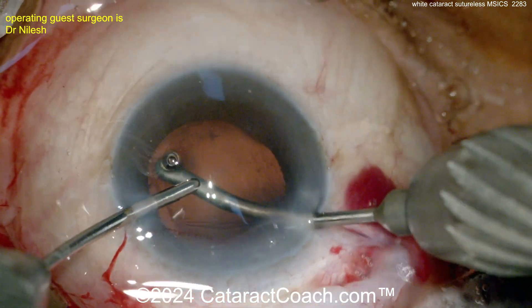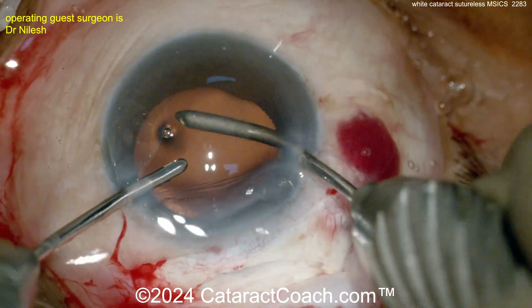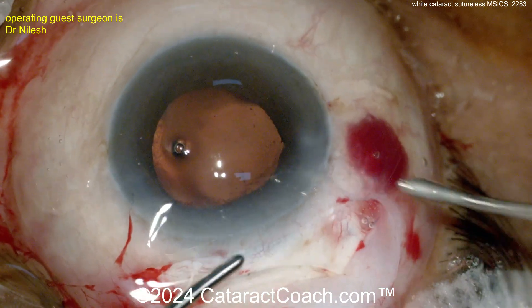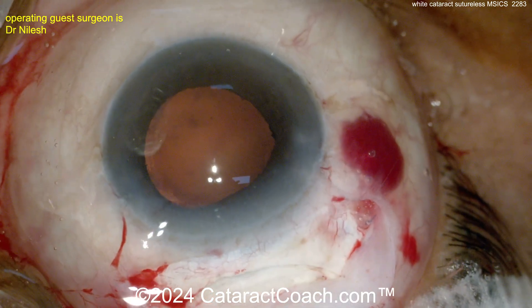Now a bimanual I/A setup to clean up the cortex — so no Simcoe cannula here. The paracenteses may have been made a bit large; if you're using a bimanual I/A setup rather than a Simcoe, which is wider, you probably could have made a smaller paracentesis.